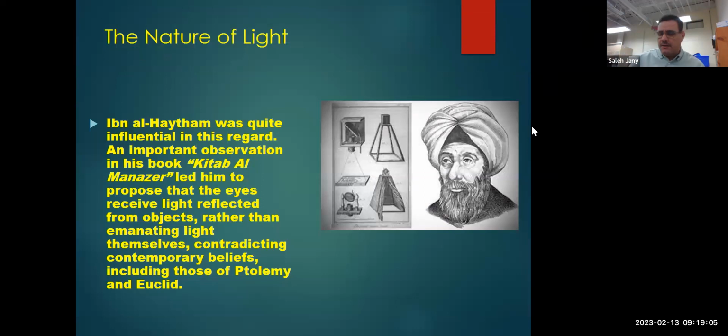So the nature of light, the history of the nature of light. Some people, during Greek time, the Greeks thought the eyes would send out light.